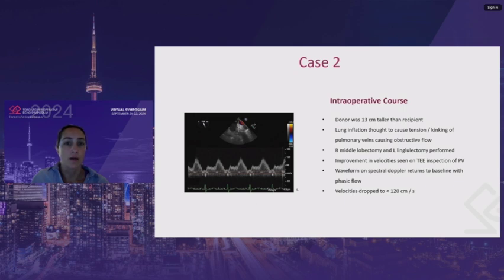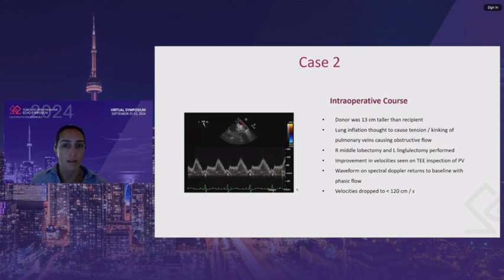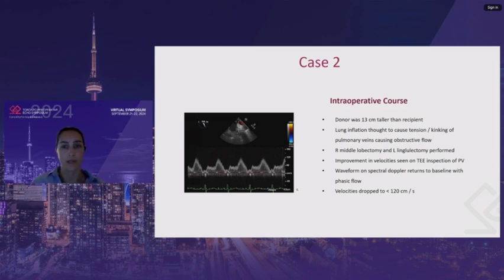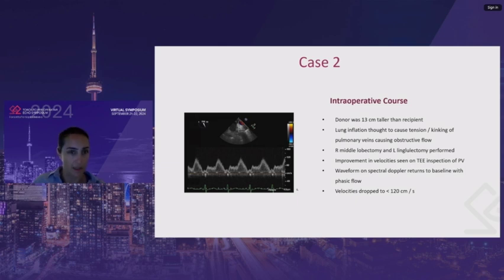The donor was 13 centimeters taller than the recipient. Lung inflation was thought to be the cause of some external tension causing kinking of the pulmonary veins and obstructive flow. The surgeon performed a middle lobectomy and a left lingulectomy. Improved velocities were seen on TEE inspection of the pulmonary veins — the waveform on spectral Doppler returned to a more phasic flow, and velocities dropped from around 180 to less than 120 centimeters per second.